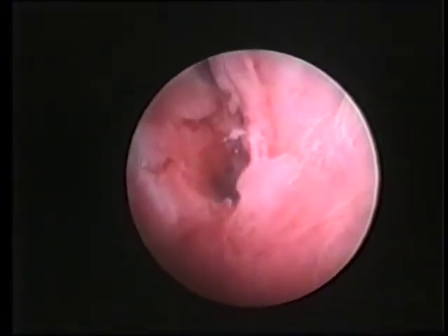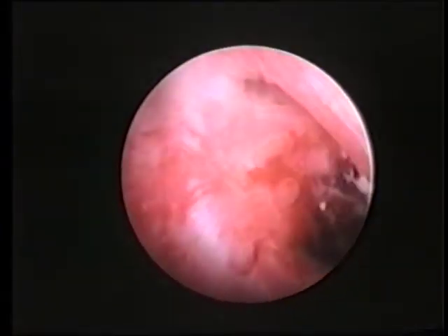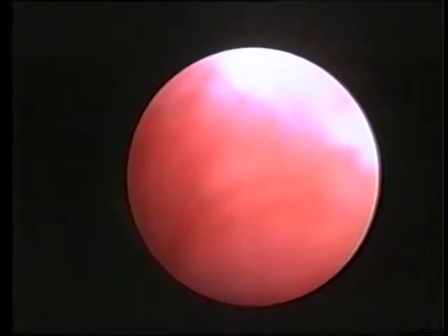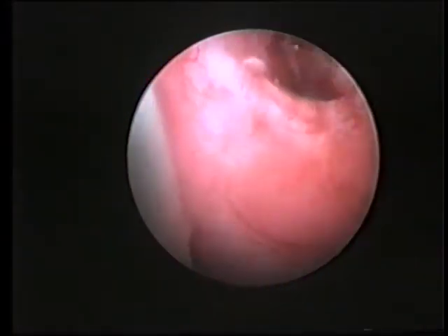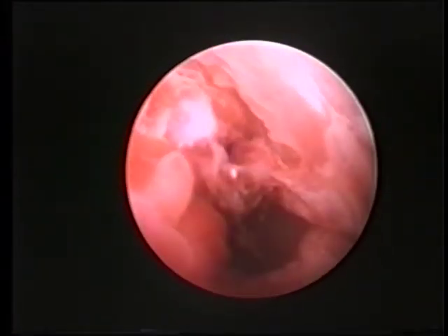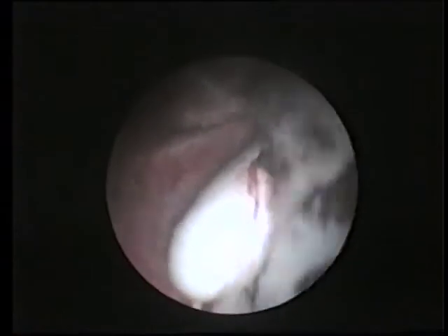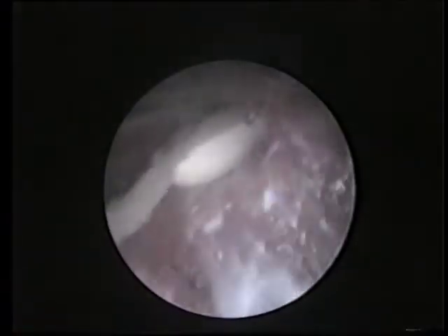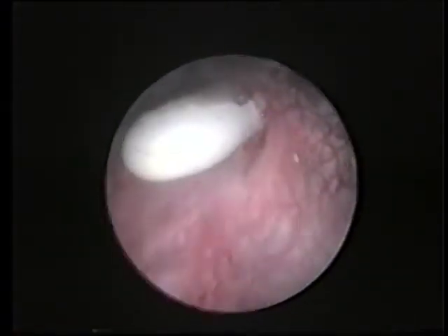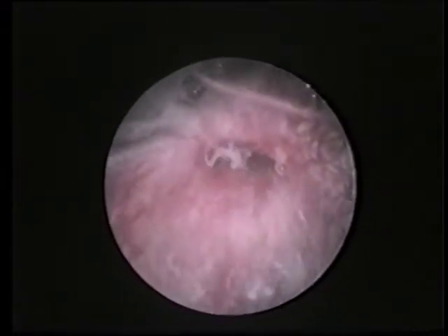A deep cavity is exposed where the catheter tip had penetrated, but fortunately not perforated, the posterior wall of the bladder, which can be thin in women. As the catheter is removed from the bladder through the suprapubic cystostomy, thick inflammatory mucus can be seen pouring out from the lumen of the catheter.